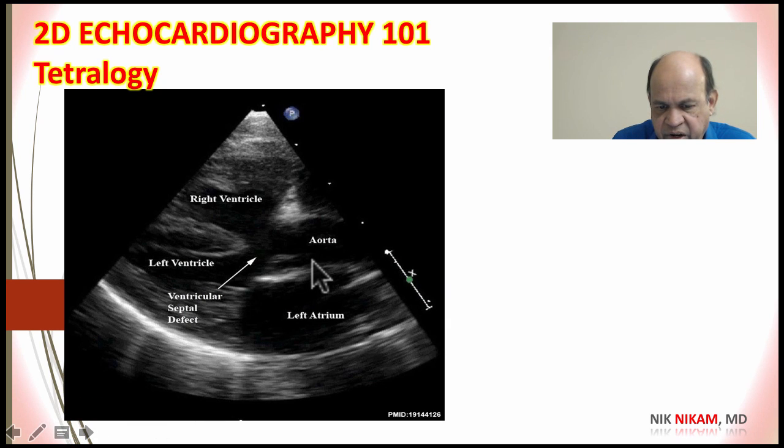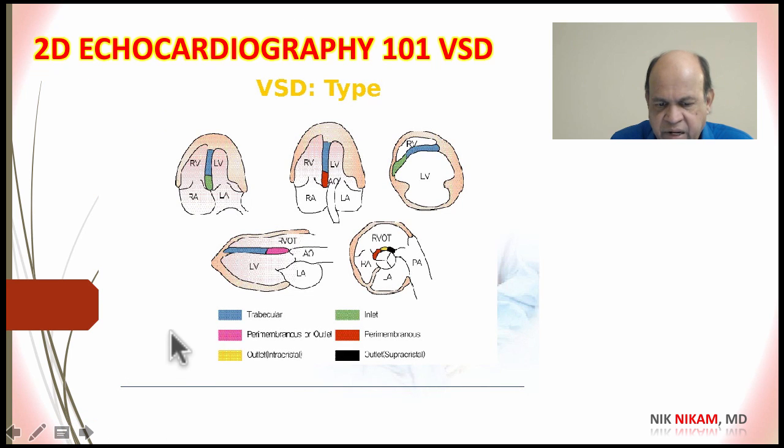Here's an echocardiographic finding. As you can see, here we have a right ventricular thickness which is increased. Here is the aorta which is also opening into the right ventricular cavity, and we have the left ventricle. Here's the left atrium, but we may not be able to see the pulmonic valve in this particular view. And next we are going to move on to ventricular septal defect.